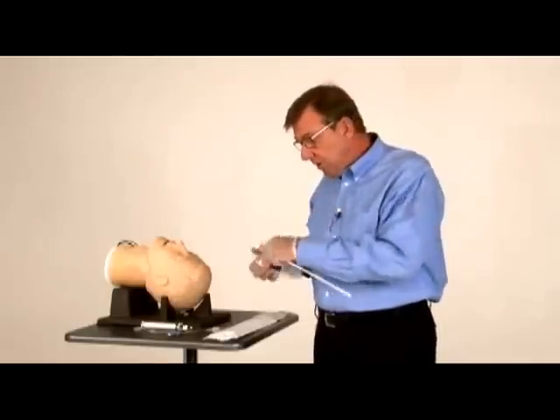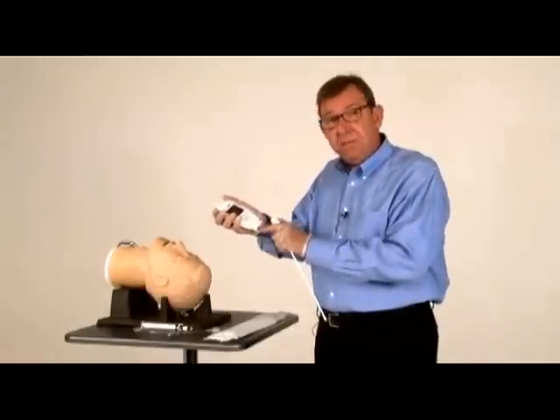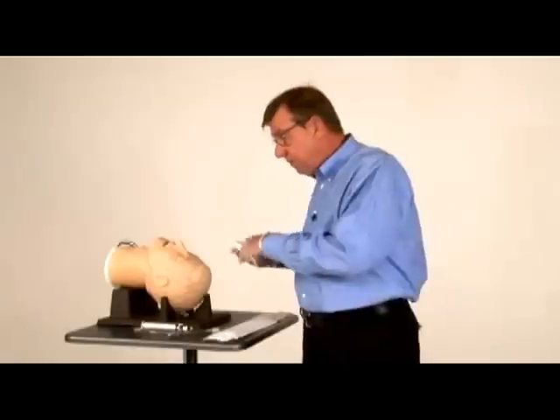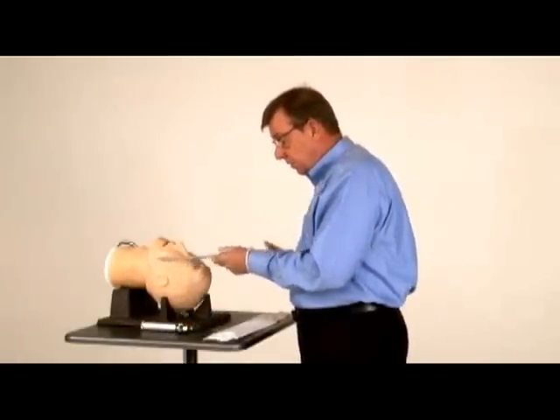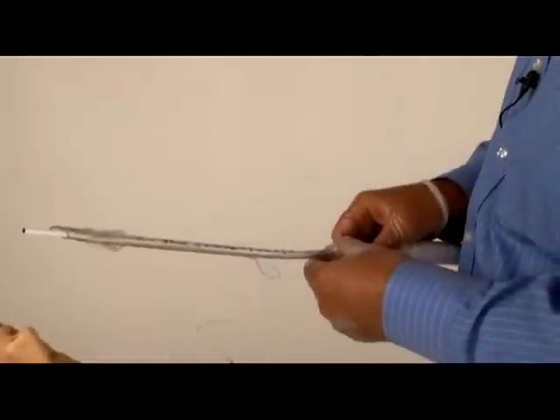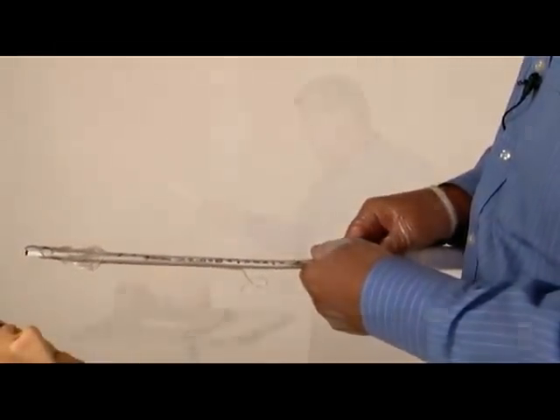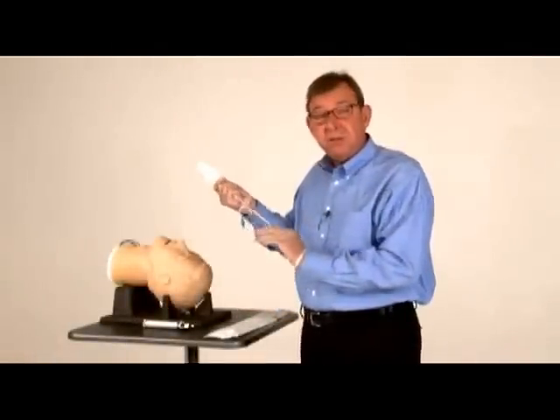To use it, you attach your stylet to the handpiece. There's a nipple and a hole in the back of the handpiece that will allow you to orient it correctly. You just snap it together and then insert it into your ET tube. Use the stopper to secure it at the appropriate length so the camera is just right at the end of the tube. Then lubricate around the balloon to make it easier to pass through the cords.